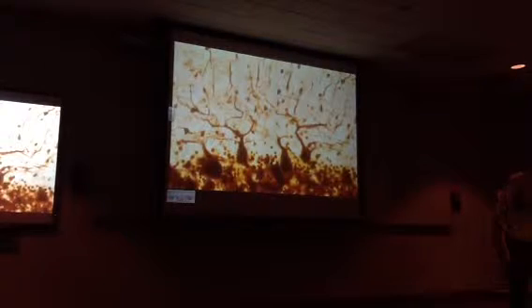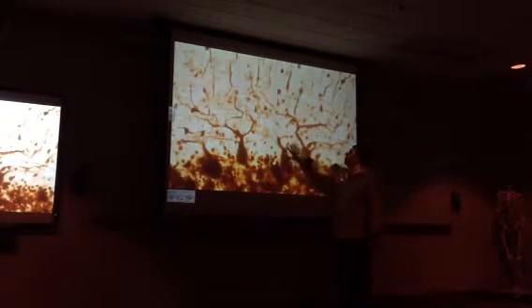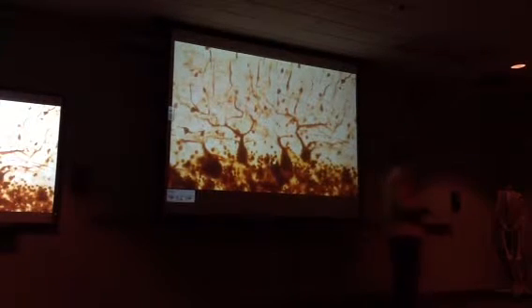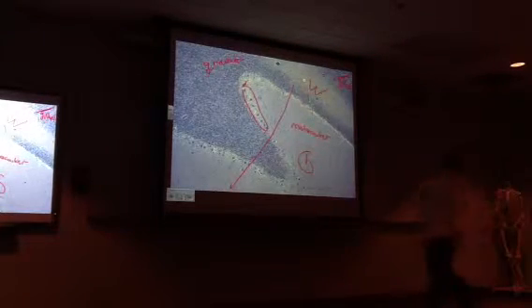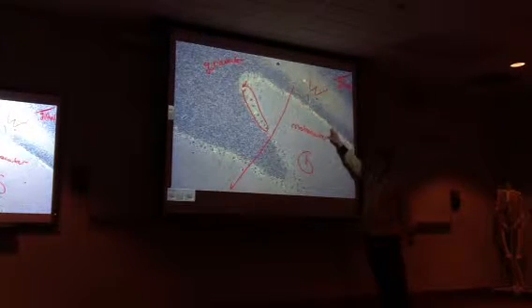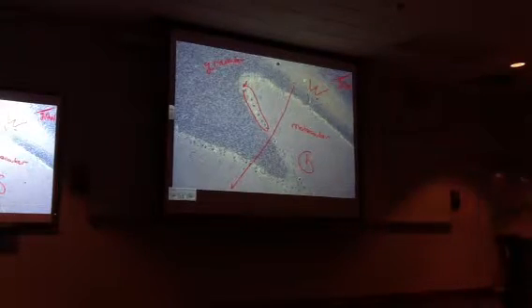This is just, again, a silver stain, just showing the Purkinje cells, and you get a sense of the dendrites coming from it. I'll back up a second, too. The Purkinje cells might also be sending axons out into the white matter. They could be coming all the way through the granular layer and sending axons out into the white matter.